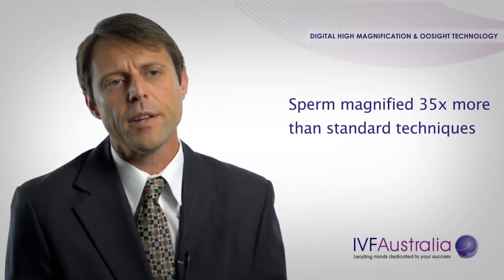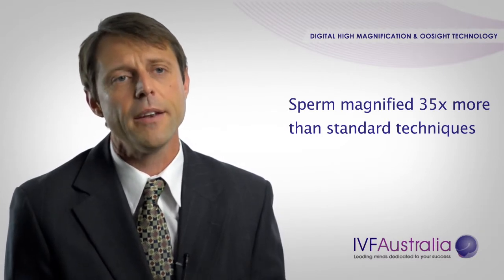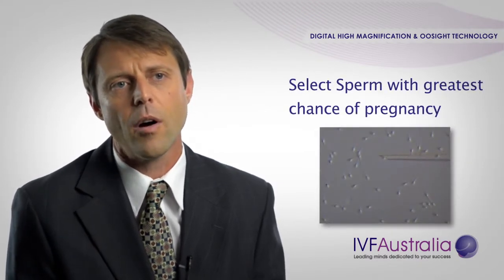Digital high magnification is a process we pioneered at IVF Australia back in 2008. In this process, we can see a sperm 35 times more magnified than a sperm from standard ICSI. If we can see that, we can determine how many defects that sperm has, and we can compare it against a criteria that gives us the ability to select a sperm that has a higher pregnancy chance and a lower miscarriage rate. There are three groups of patients that benefit from this type of technique.